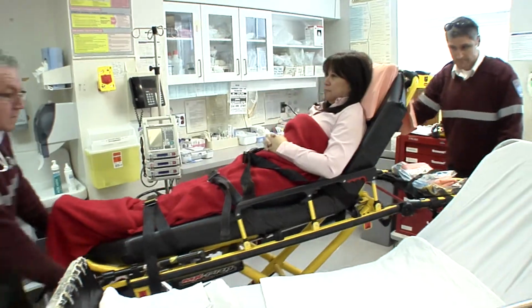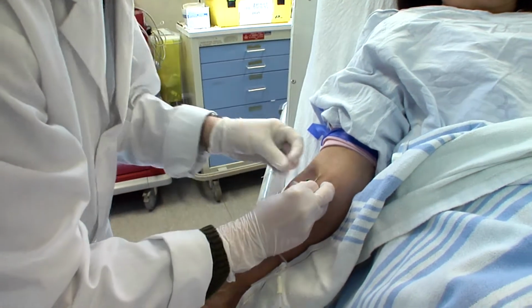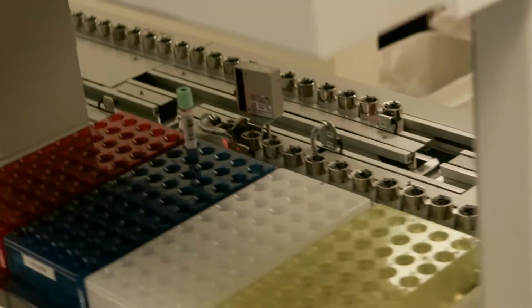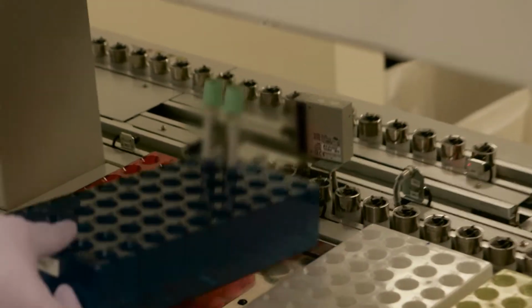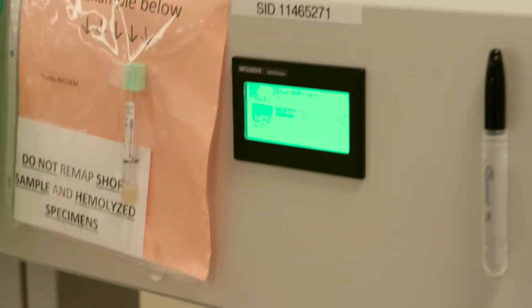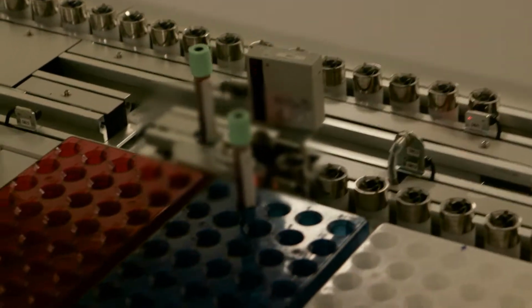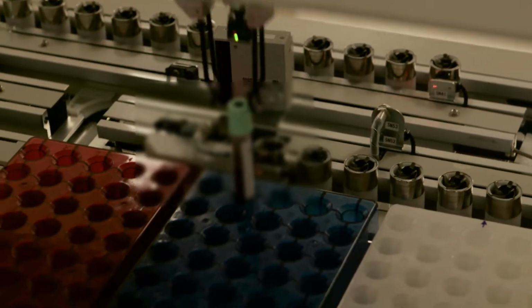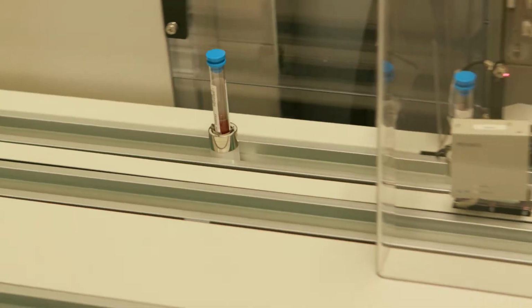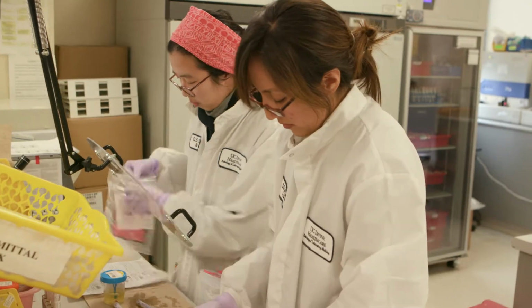That's actually a life or death situation, and you need to know as soon as possible if a heart attack has occurred. At the clinical lab, such as here at UC Irvine, the lab team immediately goes into action to find out the cause. The sample is processed, loaded onto the automation track, analyzed, results verified, and released to the ordering physicians. All of this in 30 to 60 minutes. Accuracy and speed of results provided by diagnostic testing is critical.